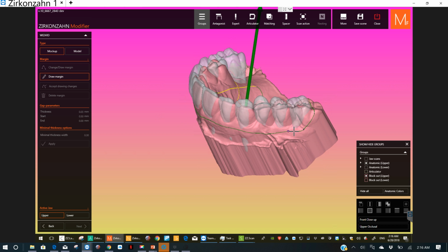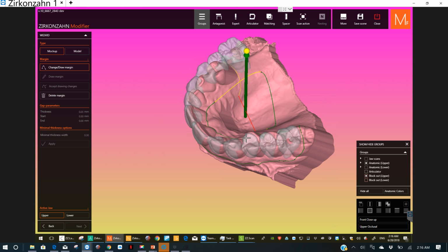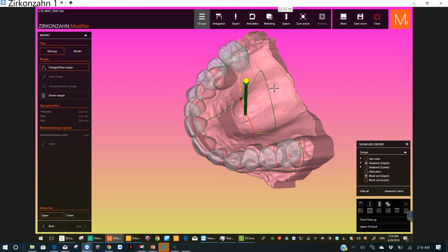Okay, so when you get to the spot where you started, double click to finish it. And then it's not letting me accept the drawing changes. That should be lighting up, and it's because I got some yellow spots. Kind of screw things up, so you can grab your dots and correct them, or just start over.